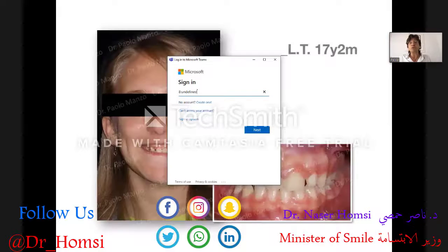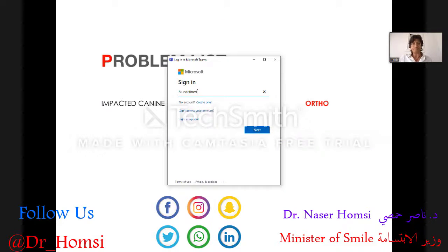Before starting this treatment, we have to assess the diagnosis. And the diagnostic part is very importantly affected by the gummy smile of this patient. Now we have a gummy smile, but we don't have a deep bite. And we have one more problem, we will see, that is not orthodontic but a perio problem. Okay? So this is the gummy smile, this is the patient, and this is the intraoral frontal situation I was facing at that time. And now Tiziana is 17, so completely different as age.